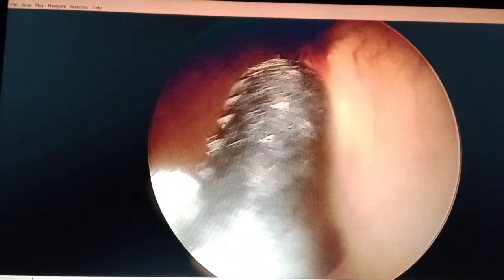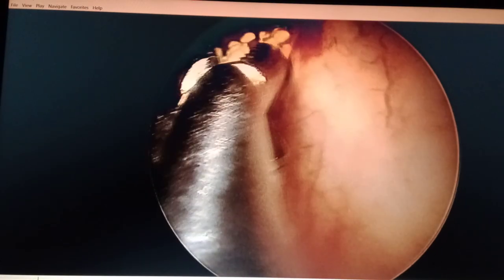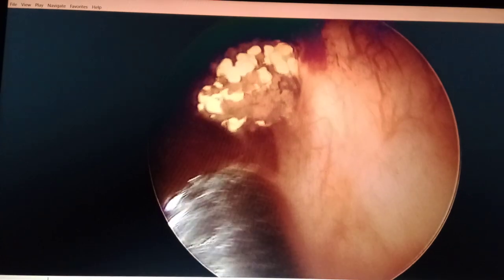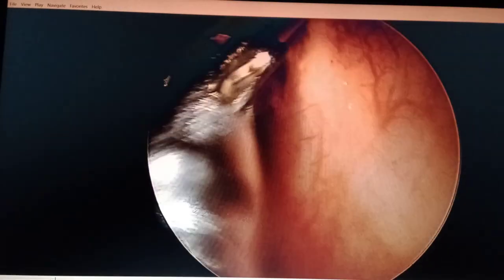Please note that for every ureterorenoscopy, cystoscopy is mandatory beforehand. Cystoscopy means to visualize the urinary bladder using a telescope specifically named a cystoscope. In this case we have identified the left ureter-vesicle opening as you can see here.